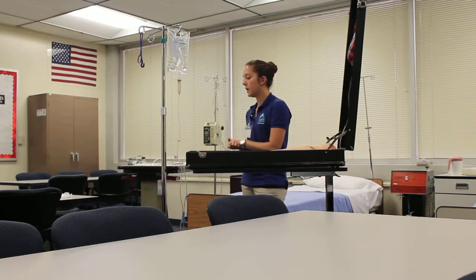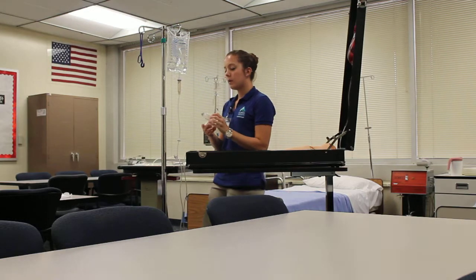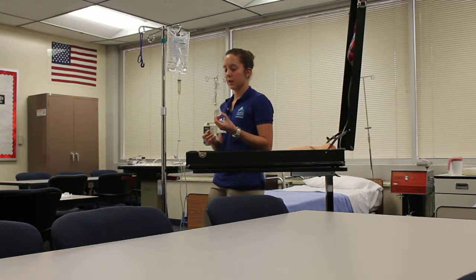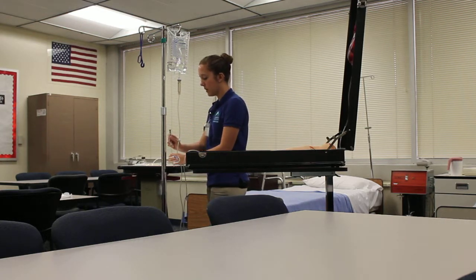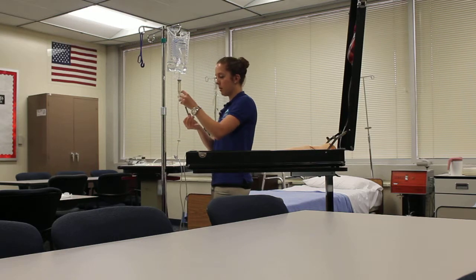At this point, I can go ahead and draw up my med. I'm going to perform hand hygiene. I'm going to look at my bottle, make sure it says Rocephin, and look at the expiration date, and it is still good. I can draw up a ml of air in my syringe, inject the ml into the bottle, and draw out my 1 ml of medication.